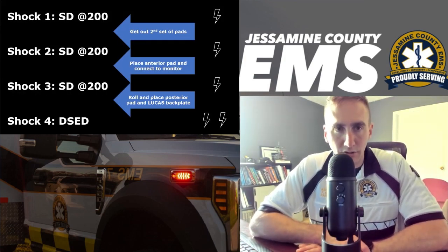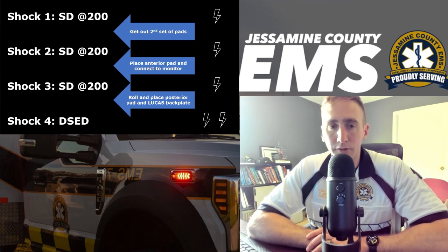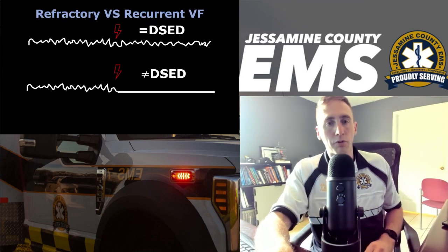Okay, so again, it looks something like this. First shock, standard defib at 200. Second shock, standard defib at 200. But after the second shock, I'm placing the anterior pad, connecting it to the monitor. After the third shock, I'm still doing the standard defib at 200, but then I'm having the posterior pad ready, rolling the patient, placing the posterior pad and the Lucas, okay, and then rolling the patient back down, resuming CPR, and then on the fourth shock, so after 2 minutes, I'm going to do dual sequential.